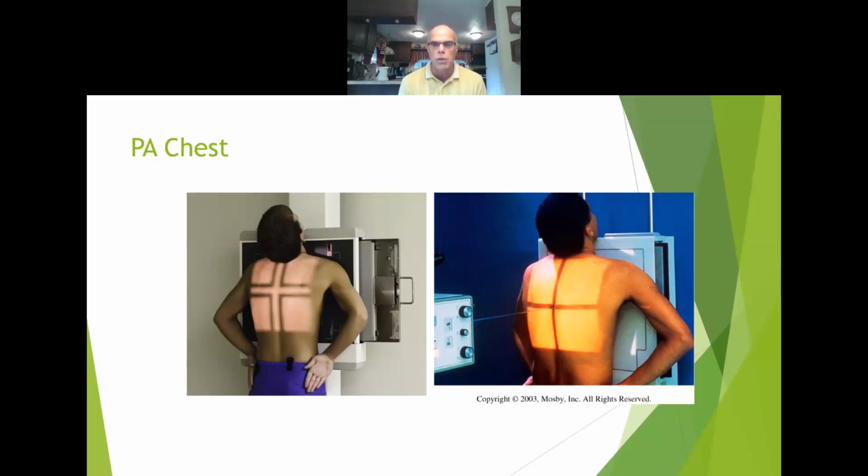So if you were actually doing what they call a cardiac series, you would not want to overinflate the lungs with the double inspiration instructions. You would only want to do it on inspiration only, not the double inspiration.